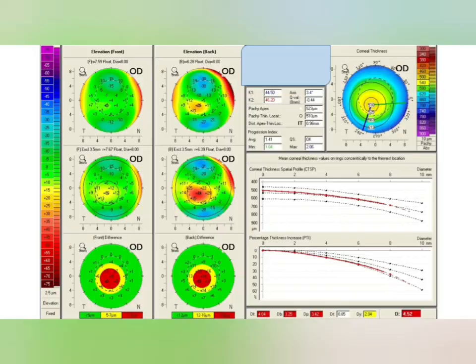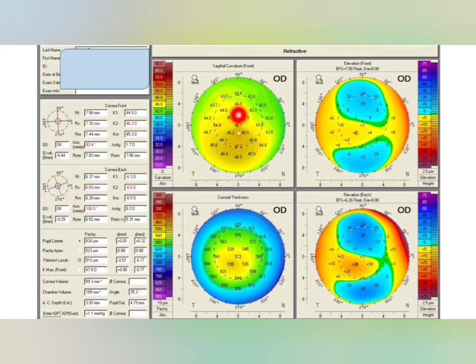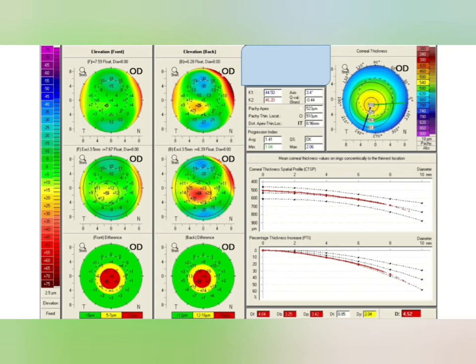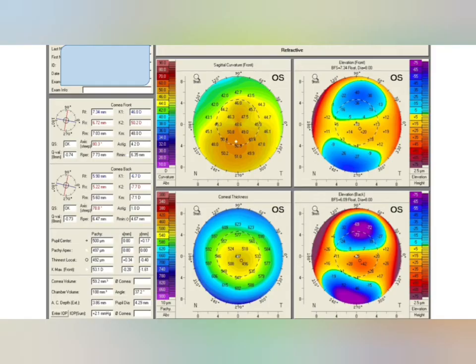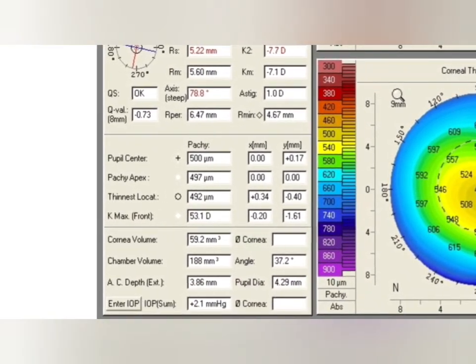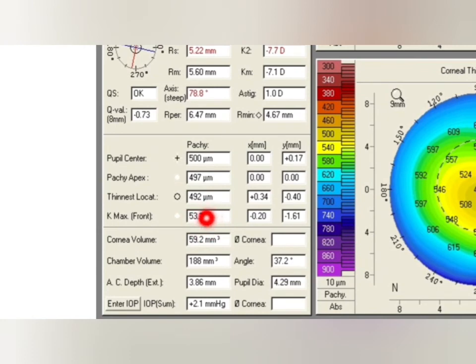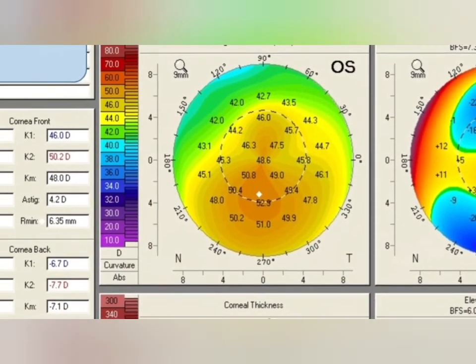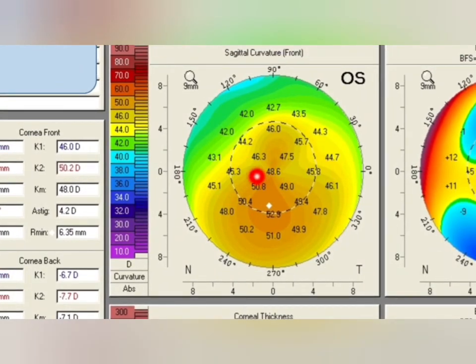So this is how you arrive at a diagnosis: first look at all the values and compare them with normal values, then ultimately check the Belin-Ambrósio enhanced accuracy map. Next case: QS and Q values are normal. Kmx value is 53.1 — abnormal, more than 47.20. Thinnest local is 492 — more than 470 but less than 500, in the borderline safe zone. Y-axis deviation is less than 0.5, normal. But the anterior sagittal map shows asymmetrical bow tie with inferior steepening and the difference is more than 2.5 — abnormal.